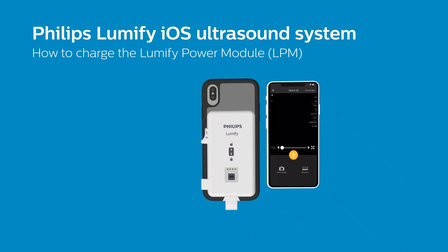In this video, we will cover how to charge the Lumify Power Module, or LPM for short. You will need a USB Type-A to USB Type-C charging cable, and it's recommended to use the cable included with your purchase.